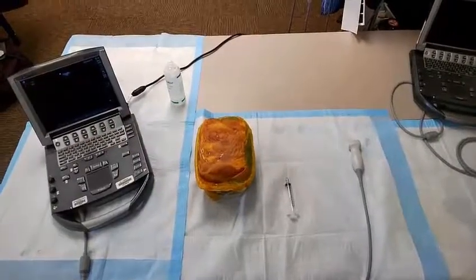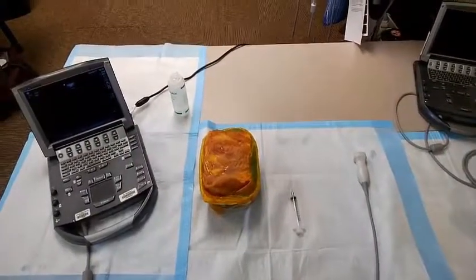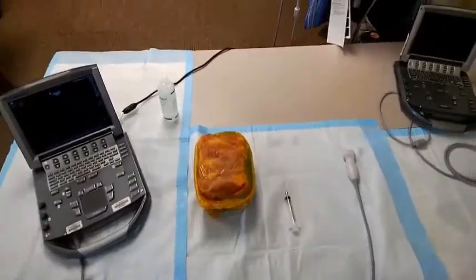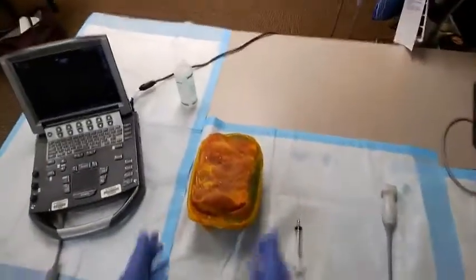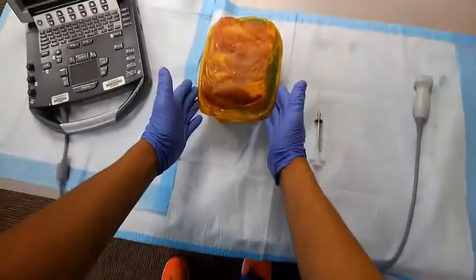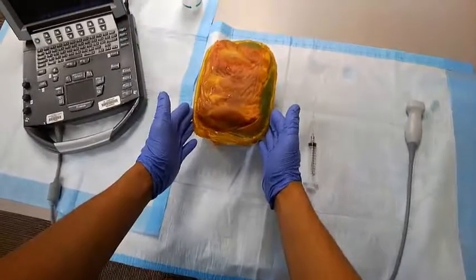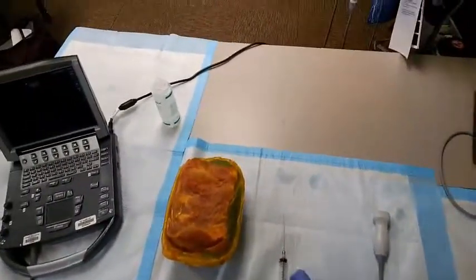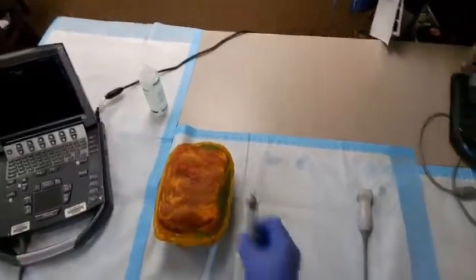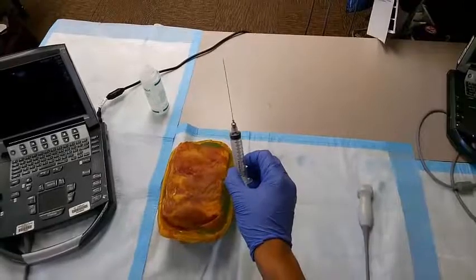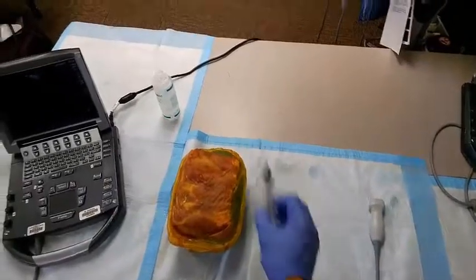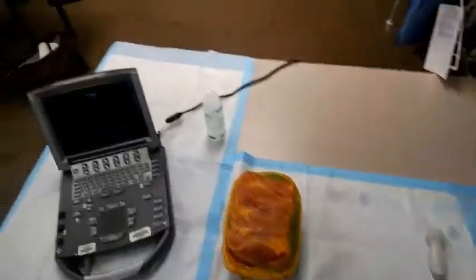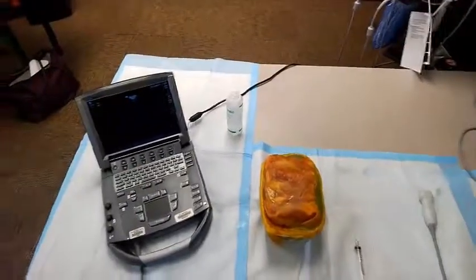I'm here to tell you how to use our ultrasound-guided pericardiocentesis model. What you need is our model, which we have instructions on how to make, a phased array probe, a spinal needle with a 12cc syringe or larger, and of course your ultrasound gel.